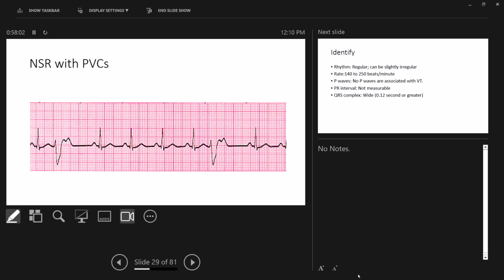Maybe it's just the quality of the screen, but I thought those would be pacemaker spikes. I thought it was pacemaker. Those look very similar, all of those spikes, especially the last one, it looks really narrow. I wasn't thinking the QRSs. I was thinking on the wide QRS. Oh, over here. You see that little spike coming up off of it?